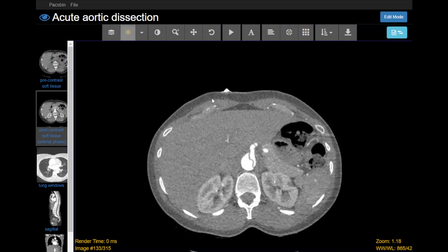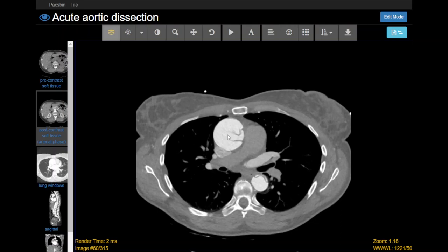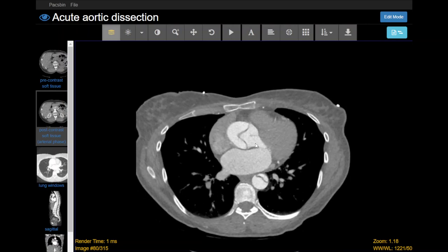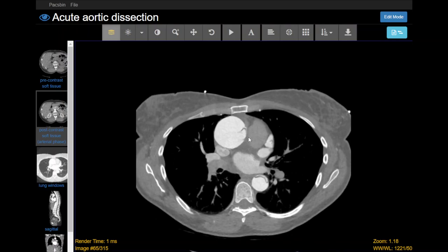That's when we can move on to the post-contrast images. Often you have to re-window somewhat in order to best see the vessels. We know this is a thoracic aorta angiogram because the contrast is concentrated within the thoracic aorta. The pulmonary artery here is relatively dark. Here's the contrast coming out of the left ventricle, and if we follow the aorta from its root, we see that there's this dissection flap.